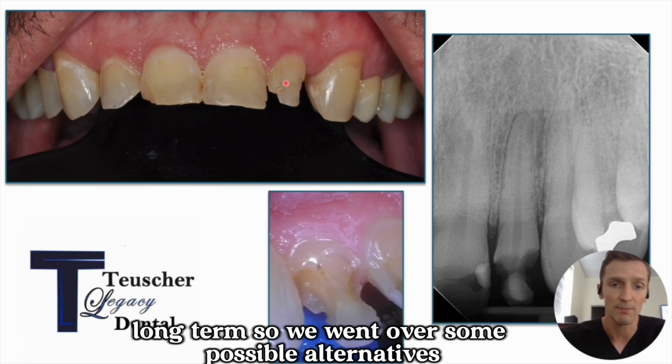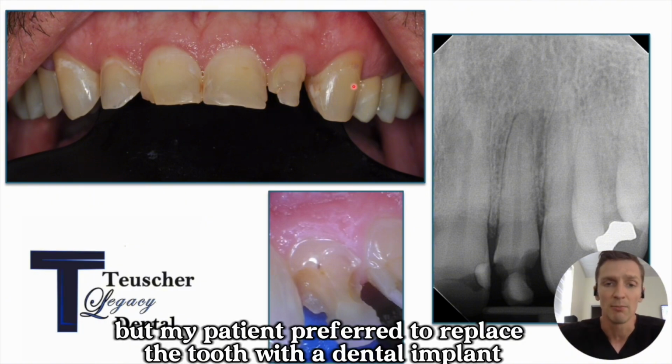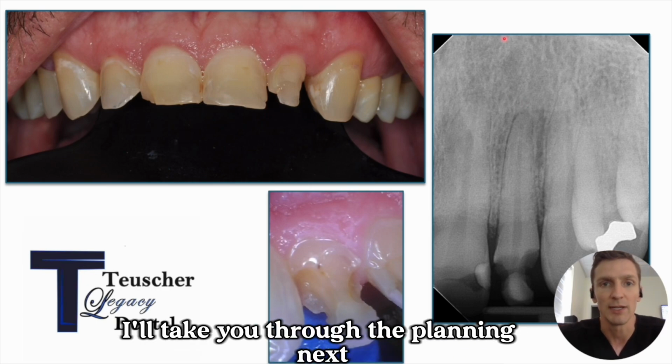So we went over some possible alternatives that included a dental bridge, a fixed bridge, but my patient preferred to replace his tooth with a dental implant. And so that's what we did. I'll take you through the planning next.